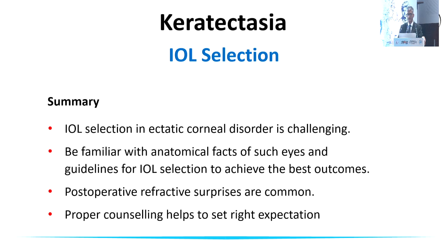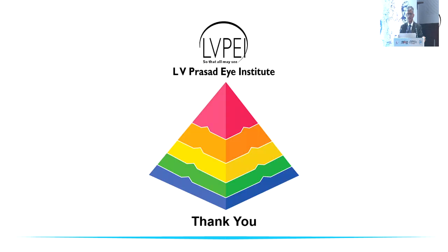We need to be familiar with anatomical facts of such eyes and the guidelines that I just narrated as far as IOL selection is concerned if you want to achieve the best outcome. The post-operative refractive surprises are common, and therefore it is important that we counsel these patients about the unpredictability that is associated when we operate cataract in these eyes. Thank you very much for your kind attention.